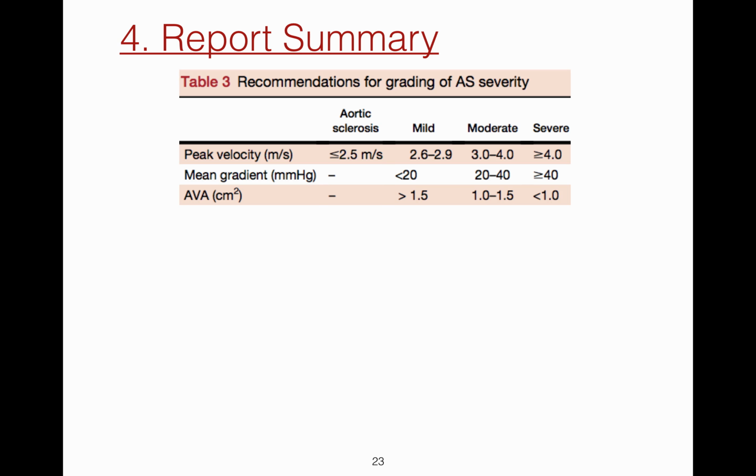Firstly, if the indication asks for an evaluation of a specific chamber or valve, be sure to include specific reference to that chamber or valve in the summary. For example, if asked to evaluate the aortic valve, include and describe, supported by measurements, the aortic valve.